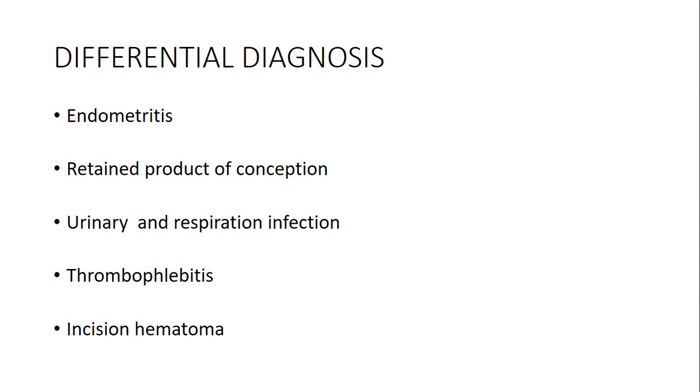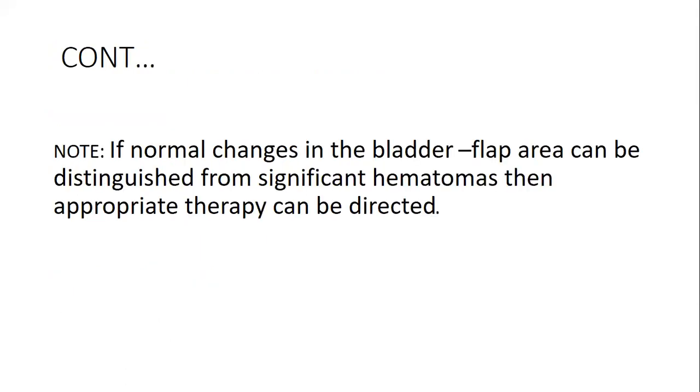So sonography becomes key. When you use a high frequency transducer, you are able to evaluate the soft tissue around the subcutaneous tissue and check exactly what may be going on there. At times you have to go deeper, where you have to use a 3.5 megahertz to actually go deeper and check what is happening between the paravesical spaces. So these differentials, they tend to come in.